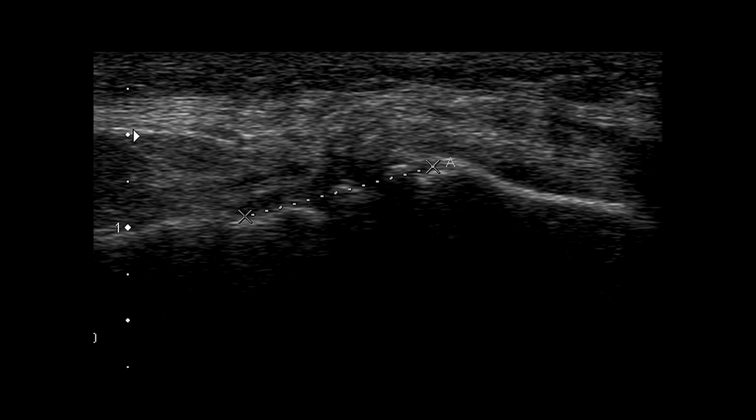Subtle cortical irregularities are visible along the surface of the proximal tibia at the attachment site. These findings, in correlation with the clinical history, are consistent with a previous injury and chronic remodeling at the enthesis.